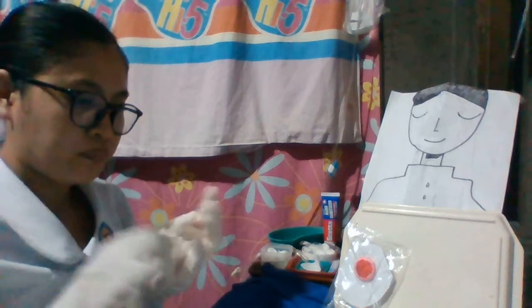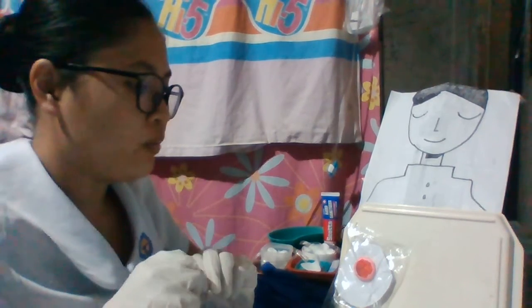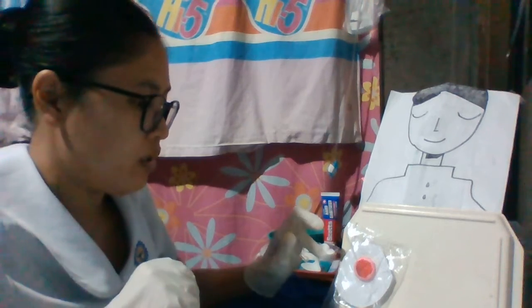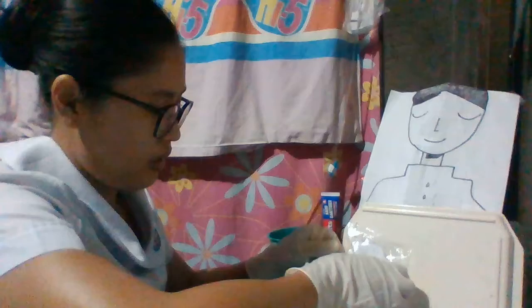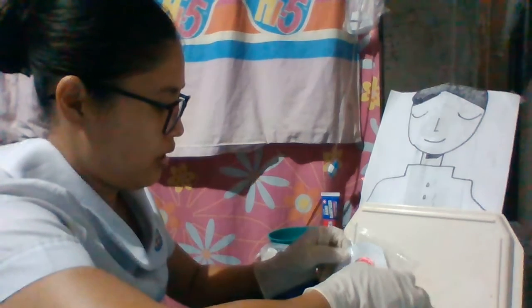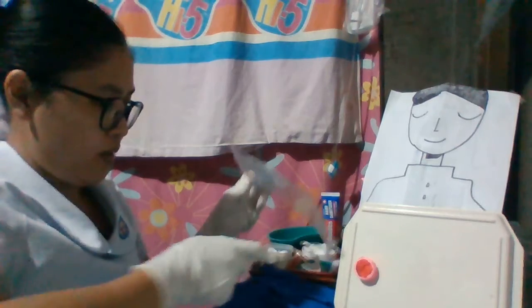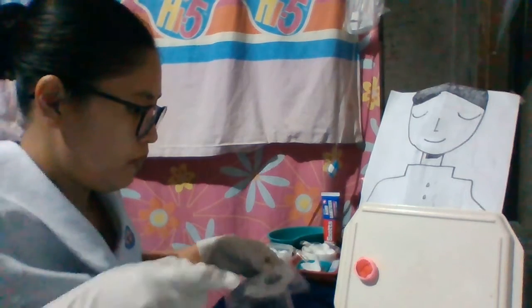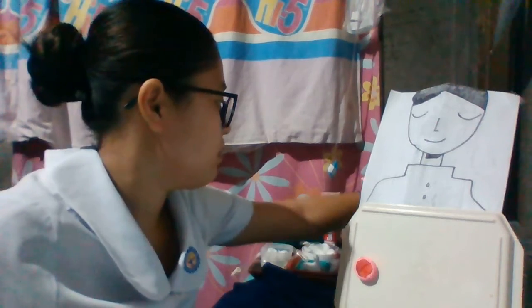Then next, we're going to remove the old colostomy pouch and wipe off fecal residue with a damp washcloth, while completely assessing the stoma and peristomal skin integrity.